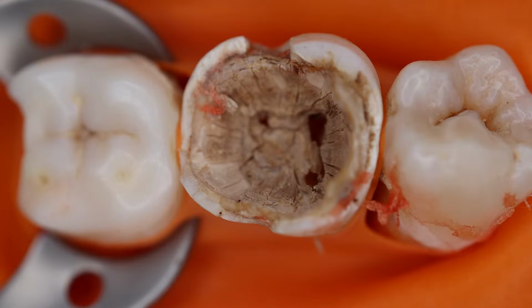Hi everyone, today we have this mandibular molar and we are going to do a live access cavity preparation for this grossly carious mandibular molar. The key thing that we need to understand is that when we are doing an access cavity preparation for this type of tooth, we should have a good judgment of whether this tooth is one that we can save, and only with a proper diagnosis should we proceed.